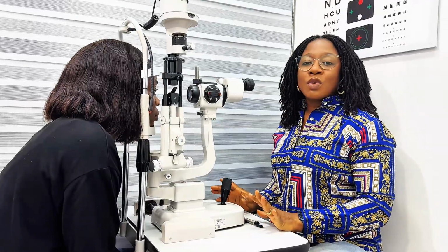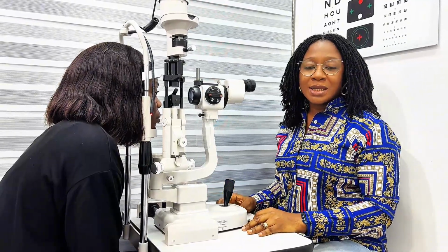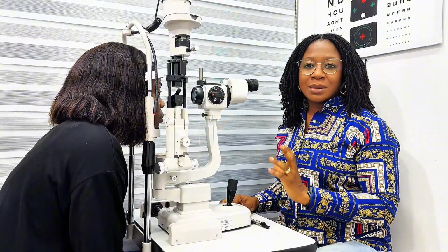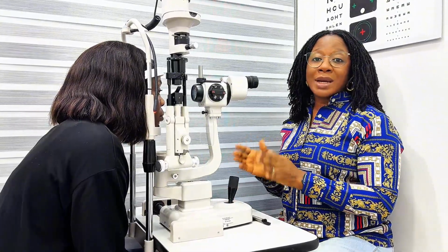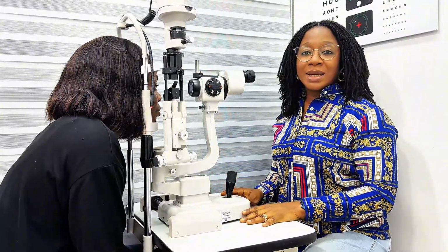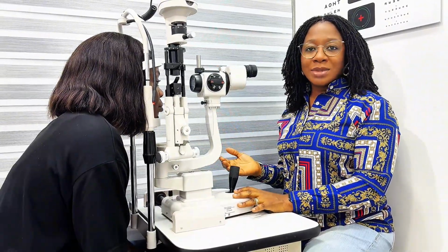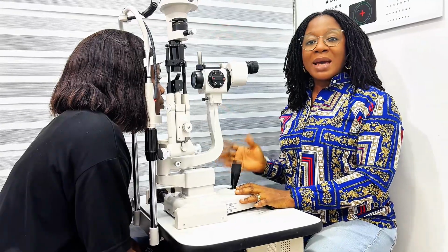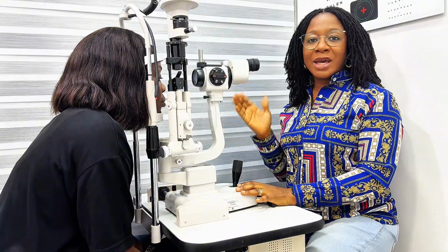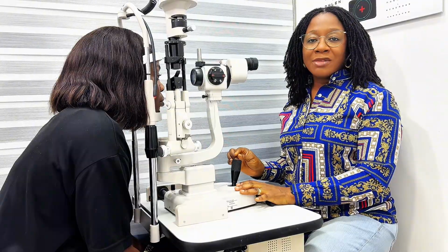Someone asked a question under the comment section of my optic section technique. She said that I needed to show how I got my narrow beam. So I'm going to be showing you right now how I got my narrow beam. For the Von Herick technique, we'll be using the same illumination that we used in our optic section technique. Remember I said that the slit width has to be narrowest, like a knife edge width. So I'm going to be showing you right now how to get that knife edge width.